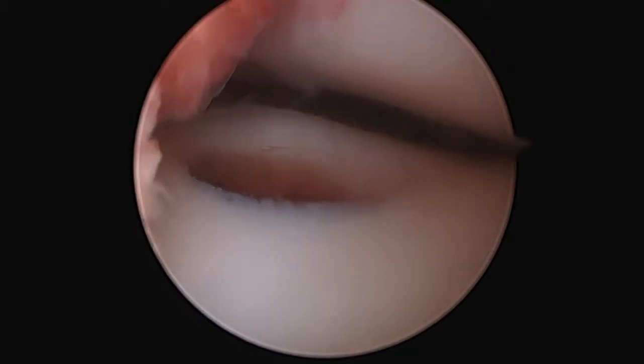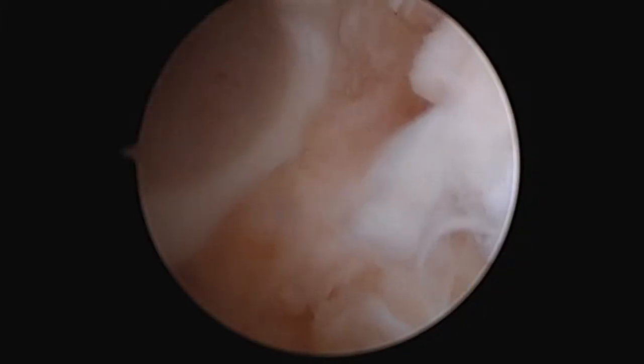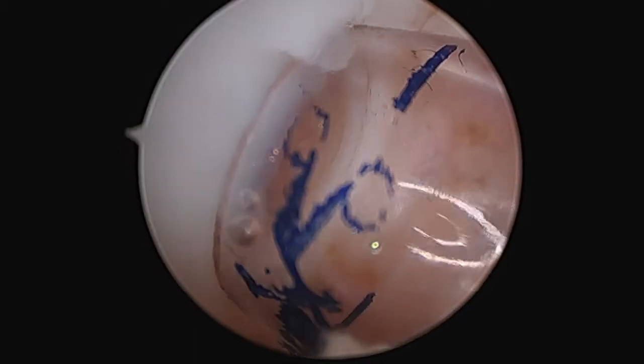There you can see the donor site after I have harvested the OATS plug. Now I am preparing the injury site. I have cored out a circular plug and now I am going to insert the osteochondral autograft.